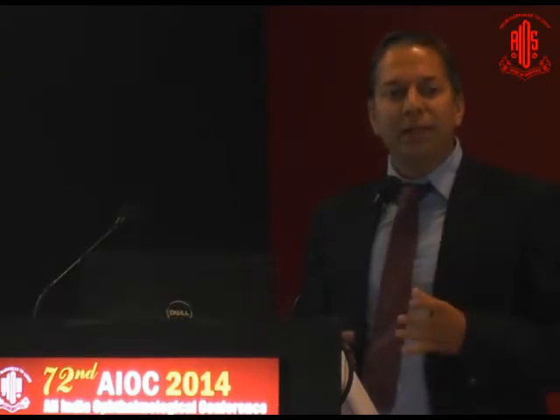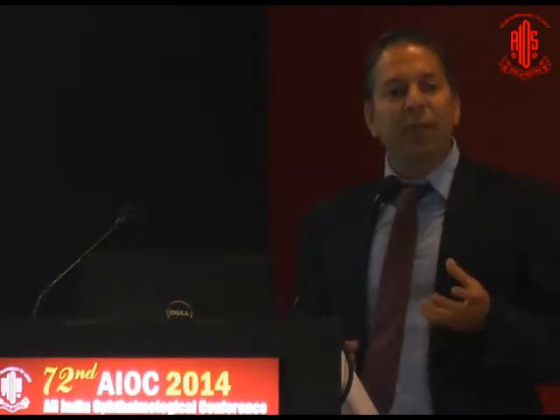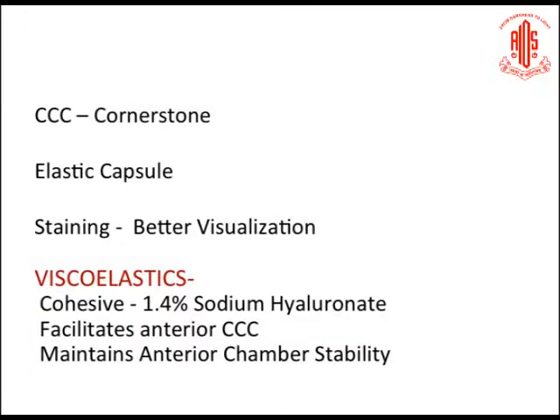A tip here is that when we are doing an anterior CCC, one has to keep the eye hyperinflated because you want a flat anterior capsule. But when you deal with the posterior capsule, the misconception is that we should again have a very taut eyeball. On the contrary, if you overinflate the bag, the posterior capsule falls back, and your rhexis, if you aim for 1 millimeter, will end up at 4 millimeters. So when you're doing a posterior rhexis, the bag should be a bit deflated. Anterior rhexis inflated, posterior rhexis a bit deflated.